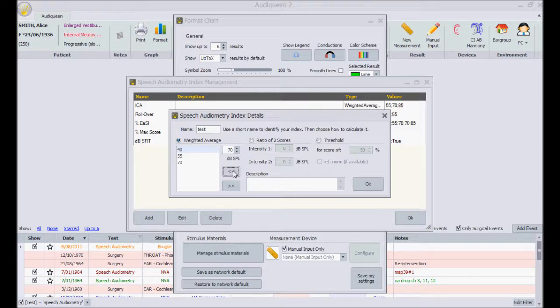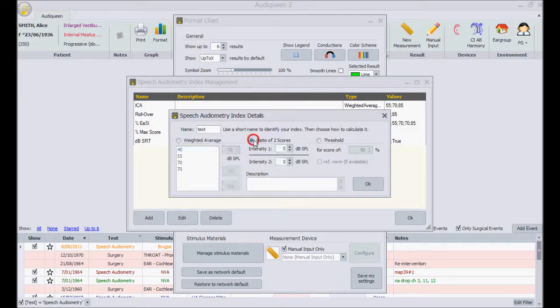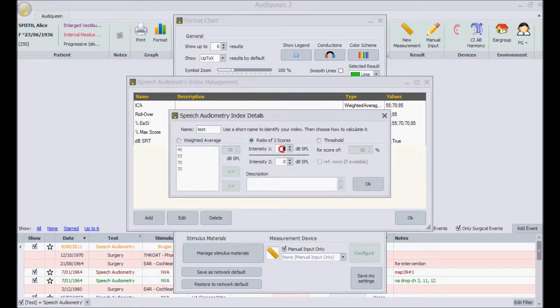If I enter one point twice, it will also count for two. Another possible index is a ratio of scores at two presentation levels. Roll over as an example.